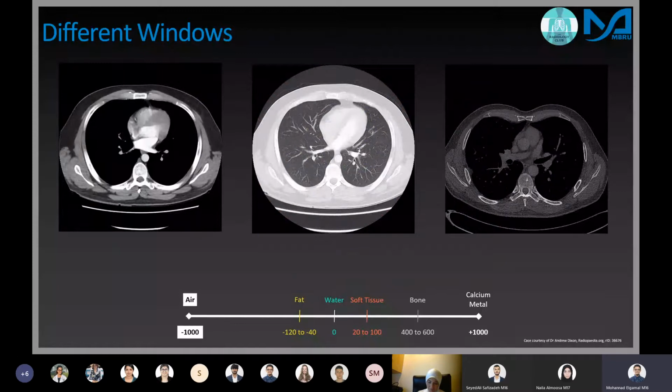Moving on. So now we talked about the different planes. Another important part of CT scans is called different windows. And when I say window, I'm basically talking about the different ranges between your Hounsfield units so you can see different things. So if we start on the far left here, we have a soft tissue window, which is usually the most common CT. It just starts off by default at a soft tissue window, and it goes from -125 to 225. You don't really have to know the numbers, just understand that it's more near the middle.